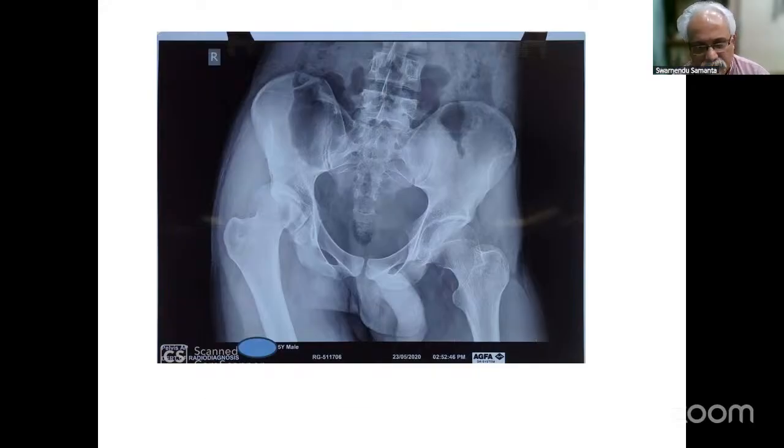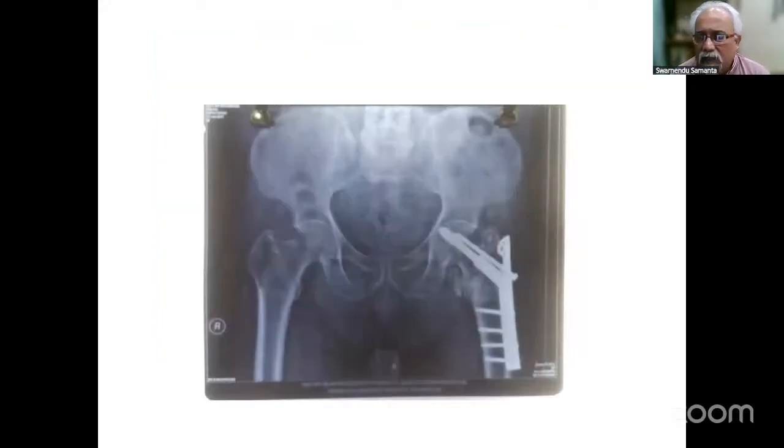Okay, those who have joined, anybody can volunteer. I will ask the question, then you tell me what is the X-ray, what is the radiology. Yes, Aswat.